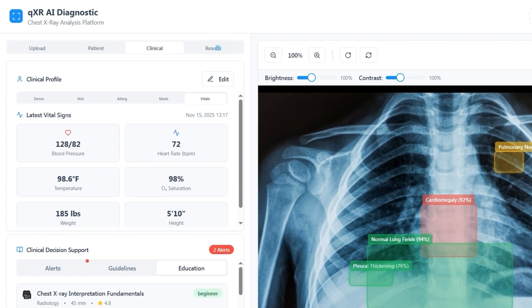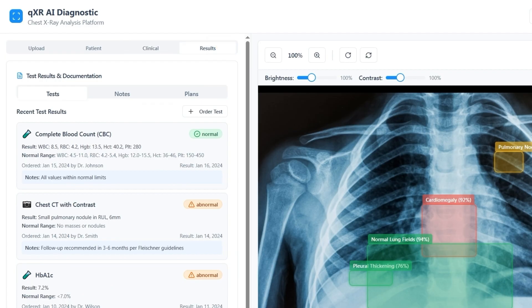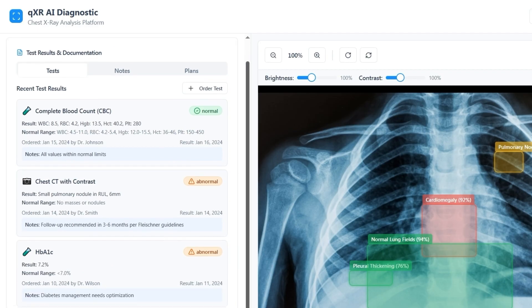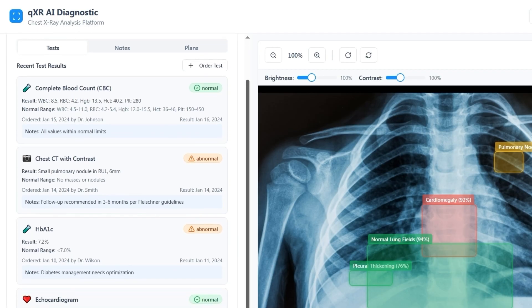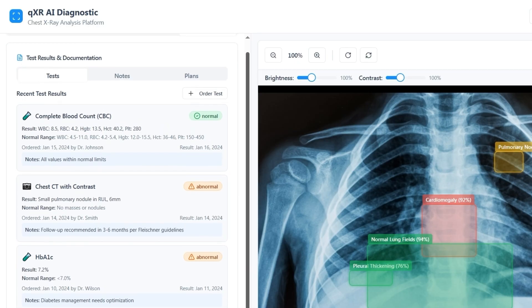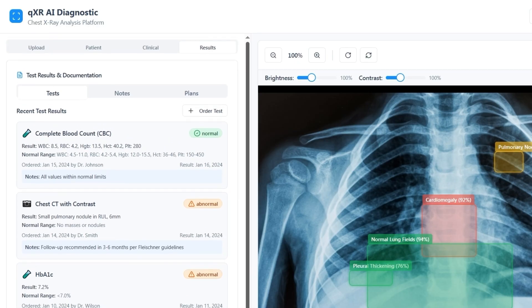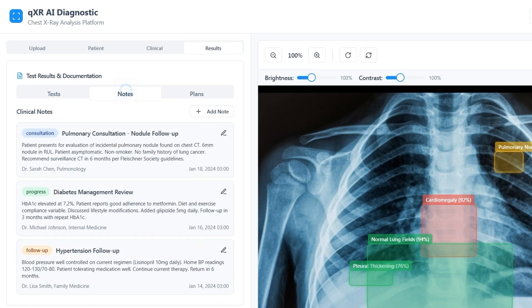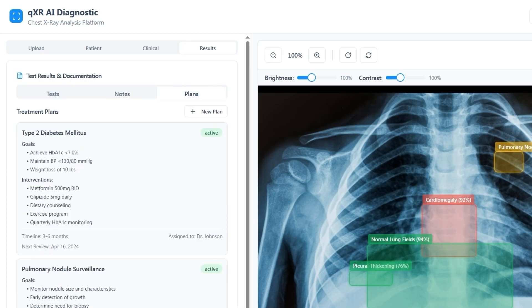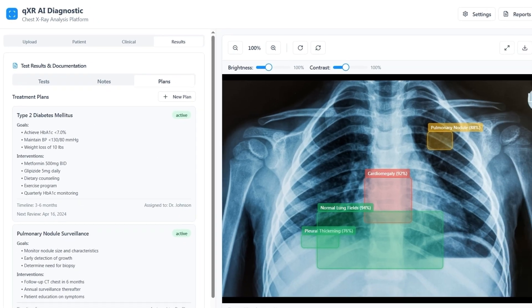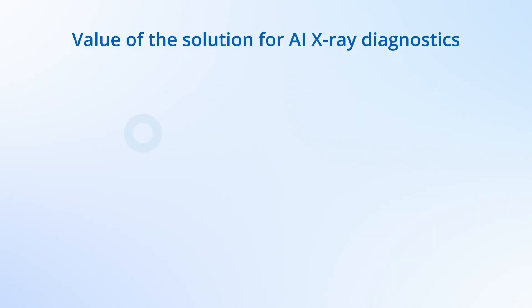The results tab shows test results pulled from integrated laboratory systems, with an option to order additional tests if necessary. Here the clinician also examines practitioner notes and the existing treatment plans for the patient.